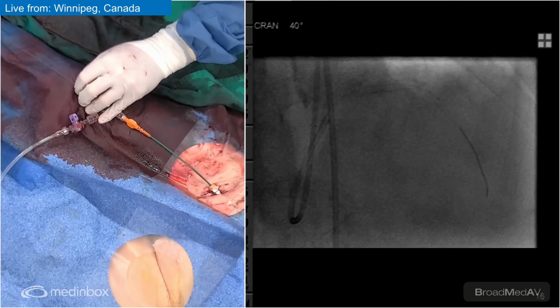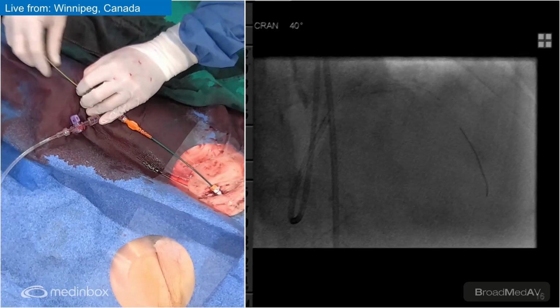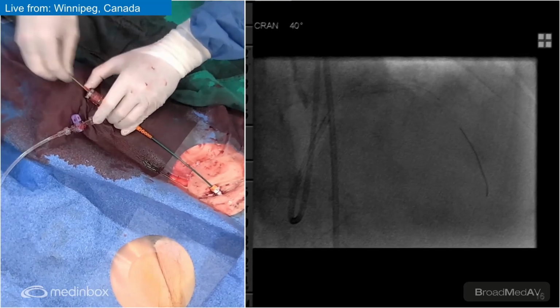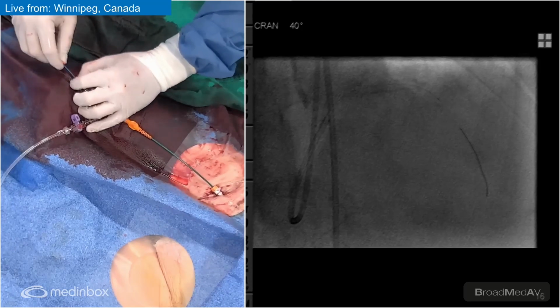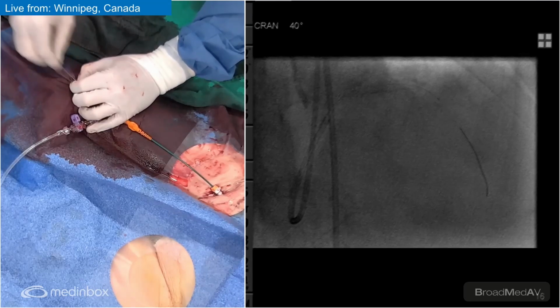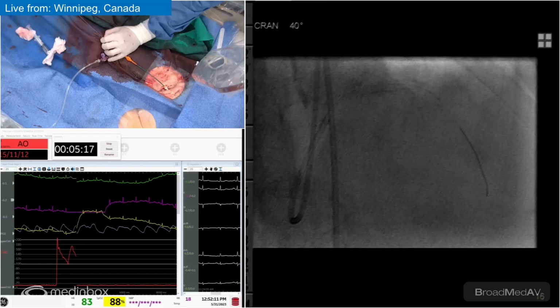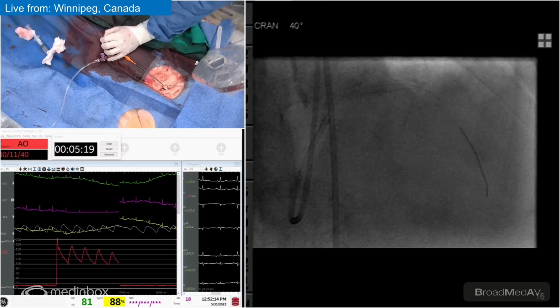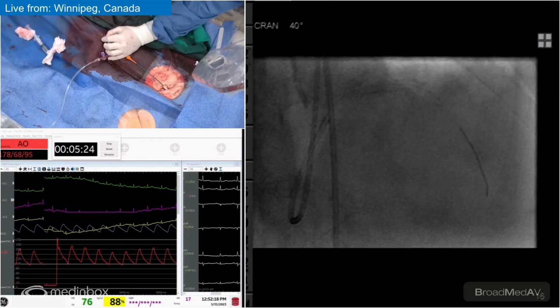Can we make sure the jaw thrust or... We're big fans of sedation in our lab. You can ask her to take some deep breaths. There we go. So the guideliner will help you straighten it out. The OCT back in there. There we go. Over time, we've become much more heavy into imaging as well. The data has been quite clear on the benefit of that.